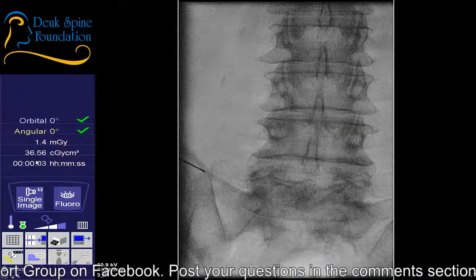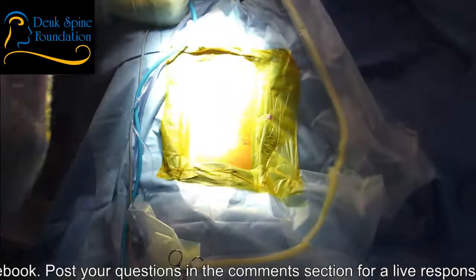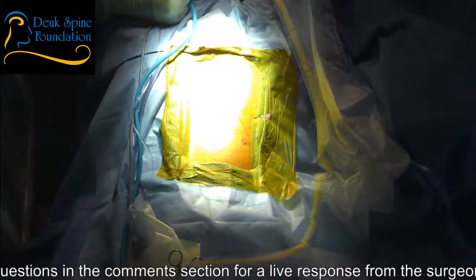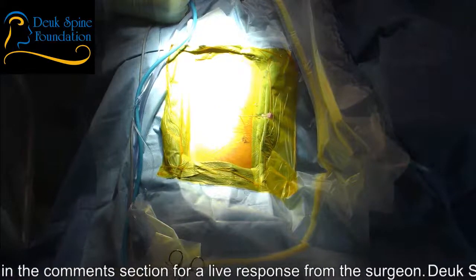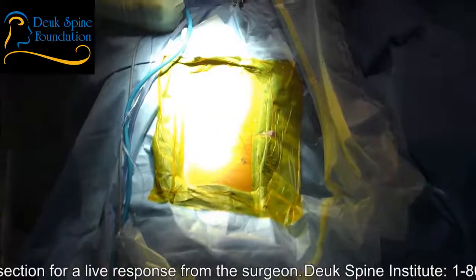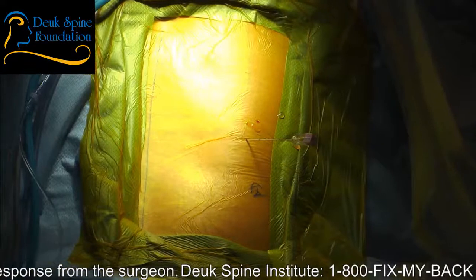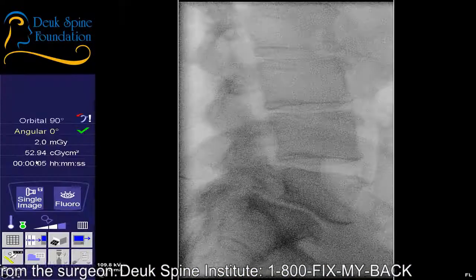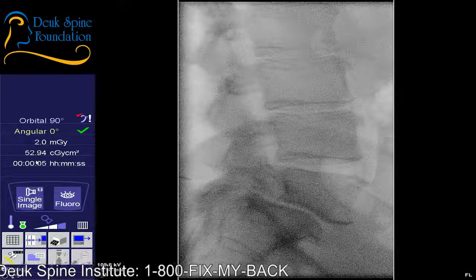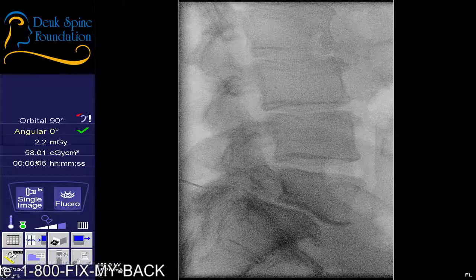Give me a lateral, please. Now, the L5-S1 disc, the one we're fixing today, that's herniated, this is the second most common disc herniation there is. And I need the table down a little bit. Stop. Now you can see the patient has spondylolisthesis as well. That's where the bones are slipping on each other. So he's not going to make it easy for me by any means. This is a really tough one to get. Well, we're going to do our best to get in there and get it done.